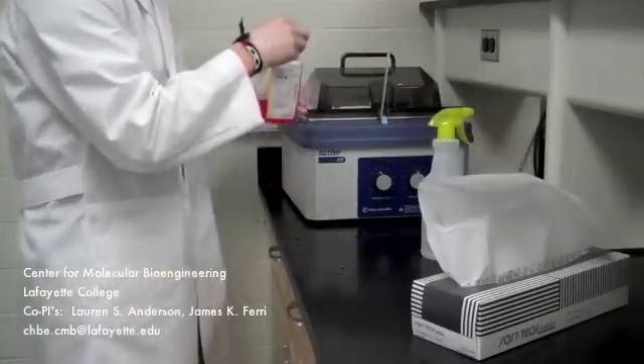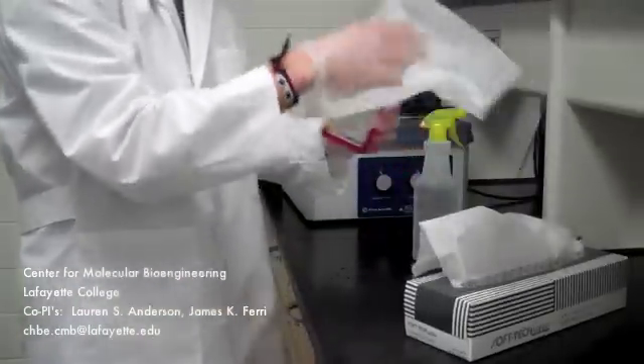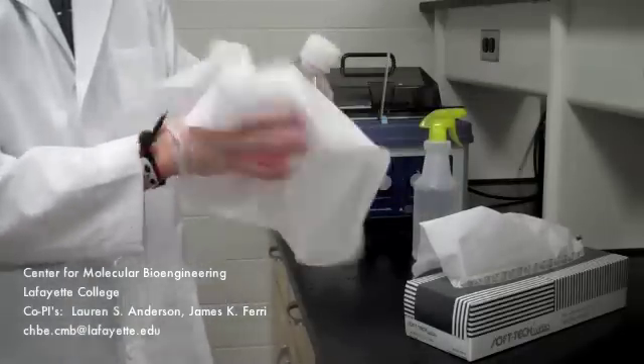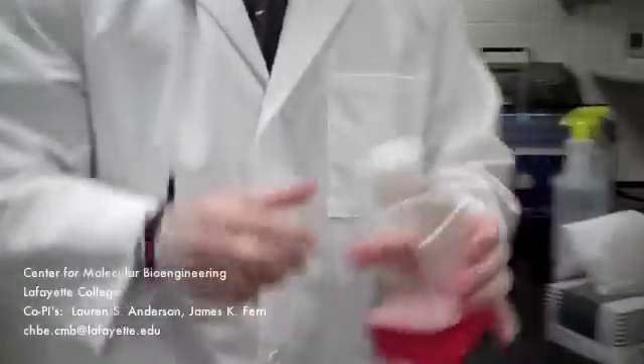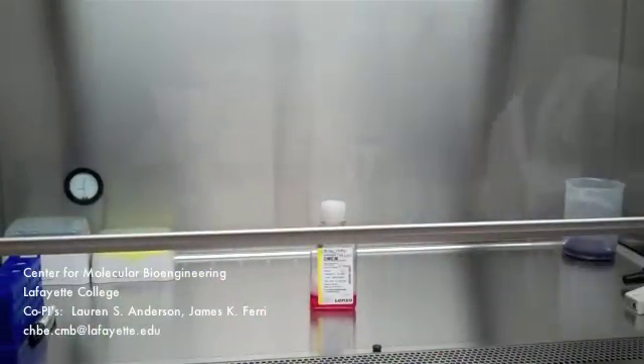Take the media bottle out and spray the entire bottle with isopropyl alcohol and wipe it down with a kim wipe. Immediately after wiping it down, place the media bottle under the hood. It is important to note that anything that is to be used on cells must be sterile. Sterile objects are never to be opened or exposed anywhere outside the biosafety cabinet.